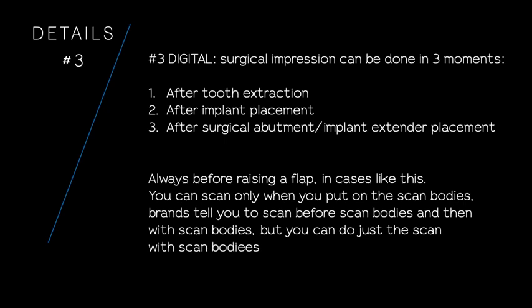You can also skip any of these previous surgical and digital impressions, and you can only scan the scan bodies, okay? As long as it is before raising the flap, you put the scan bodies on. You don't have to scan the post extraction. You just scan the scan bodies. Brands usually tell you to scan before scan bodies and then with scan bodies, but you can do just the scan with the scan bodies, and you are skipping one step, and it's not an issue.